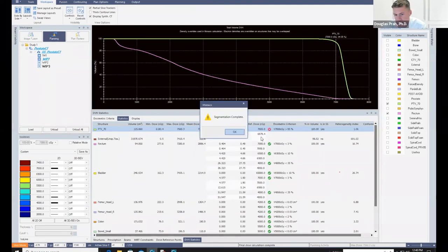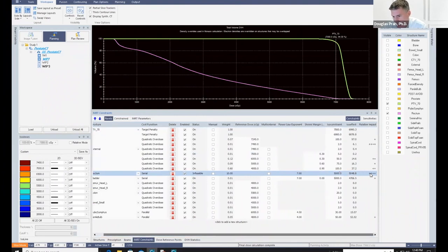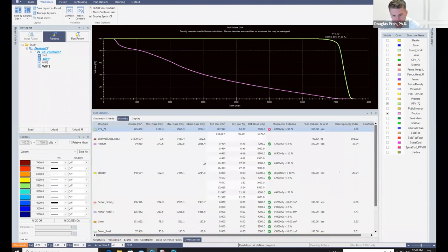So the infeasible status, that's a good question. What this is telling you is, if you go over and you look at the relative impact, the relative impact is high. So when you get this infeasible, the optimizer is saying that I've maxed out. In Pareto mode, the highest weight that OARs can be given is 10. So it's telling you that if we leave this constraint at 10, it's never going to be able to meet this constraint that you gave it, which is fine, because in this case, we gave it 5,000, but we're still meeting our underlying constraints. So there's nothing to be concerned about.